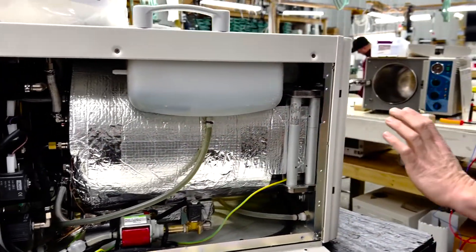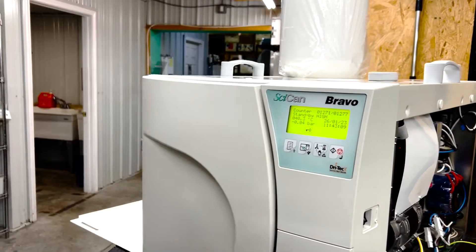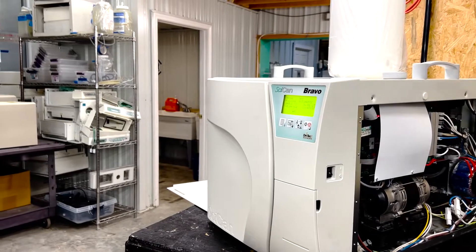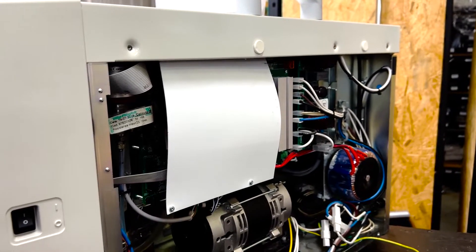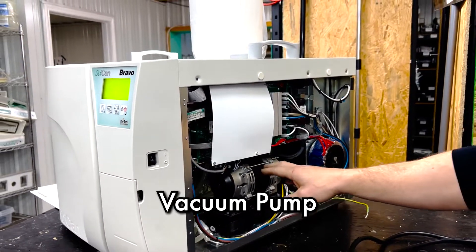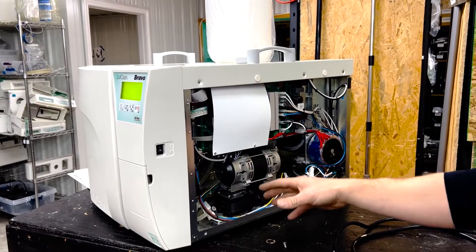If we come around to this side, there is a vacuum pump. The difference between the machines: you have the 21V, which is this model and is longer, and then you have a 17V, which is a little bit shorter. They've got the same chamber size and the same door gasket, but the depth of the chamber is different. They both have the same pump here — this is the vacuum pump. This should be rebuilt every 1,500 cycles. We can do that for you. You can disconnect this and send it in, and we can rebuild it, test it, and send it back to you.